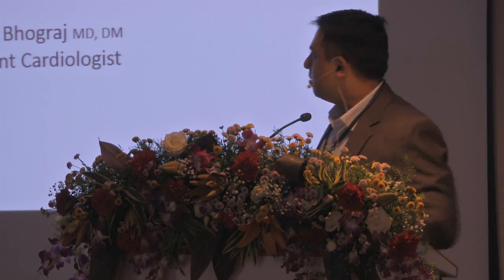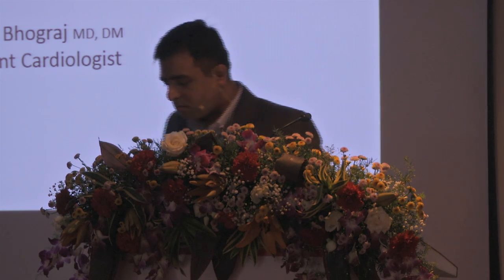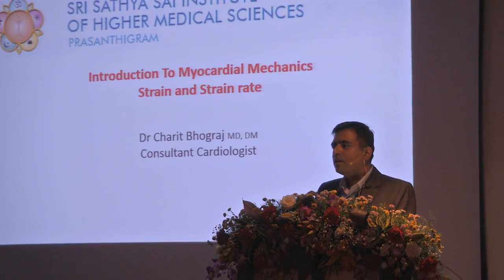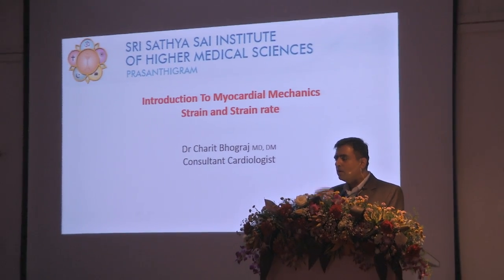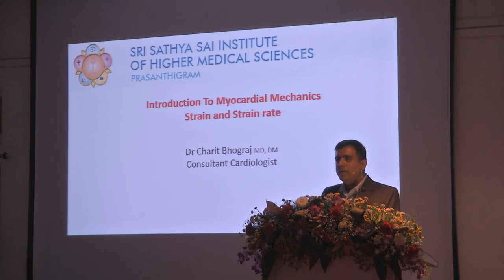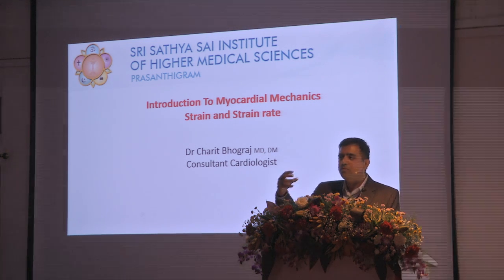Wonderful. That's good. Okay. So my topic today is the introduction of myocardial mechanics, strain and strain rate. And when somebody tells me, hey, strain rate is so advanced, let me stick to something basic, I tell them no. Understanding strain and strain rate is one of the most important aspects that you and I, as people who will treat and diagnose heart disease, need to know. We need to know this because this is going to be the future.